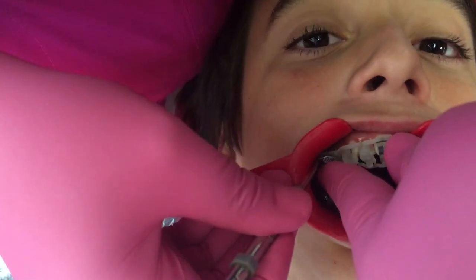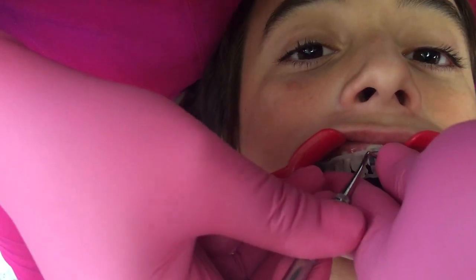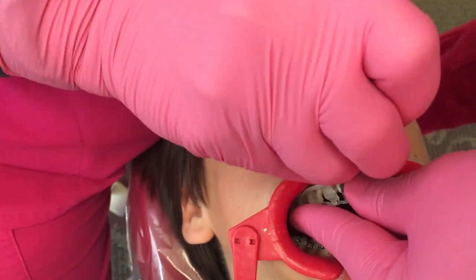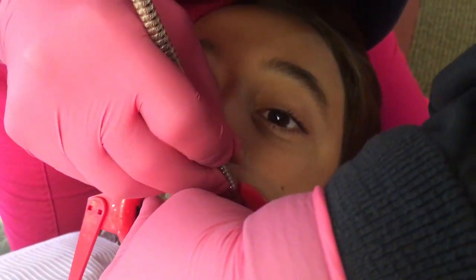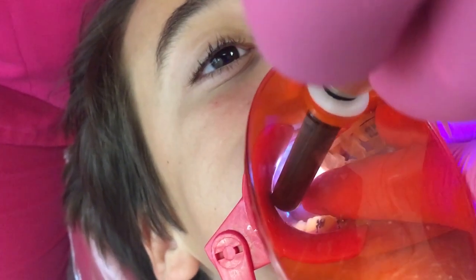Nope, you're not. Perfect, push — that's it. Sorry, you don't have to do it for so long, just push hard once and that's it. Keep on going — the centrals, you don't need too much because your thumb is in there. So just go to the bicuspid, don't release your thumb. Perfect, you finish with the bicuspid. The bicuspid — you might not see it, you might have to feel it. Feel it. Okay, so now light — good job, Drew. Sorry, you gotta stretch a little, push on the jig on the front a bit, and move to the next one, beep, and move to the next.